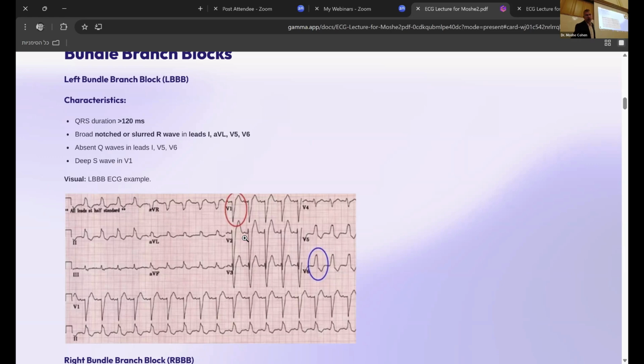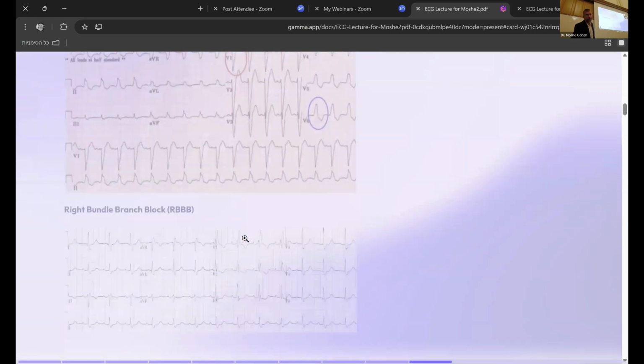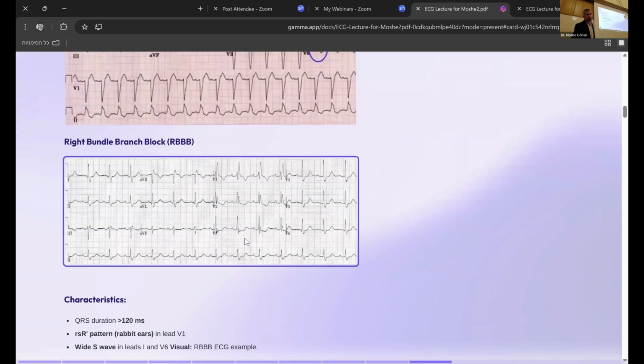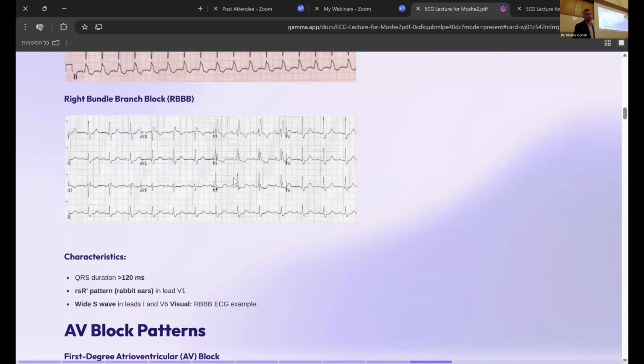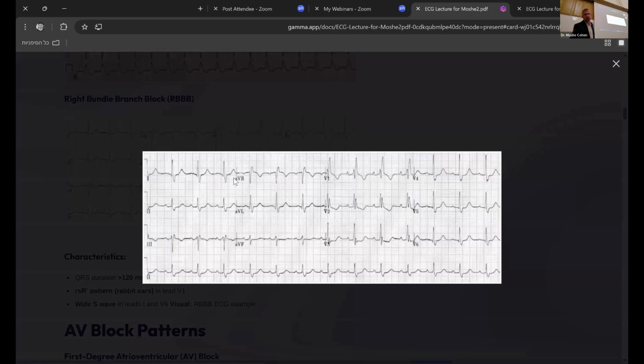Okay, let's see another one. Let's analyze this one. Okay. So let's start with the rate. What's the rate here? Remember, 300, 150, 100, 75, 60. So what's the rate here?